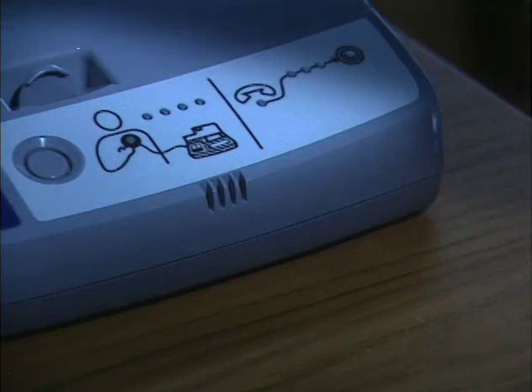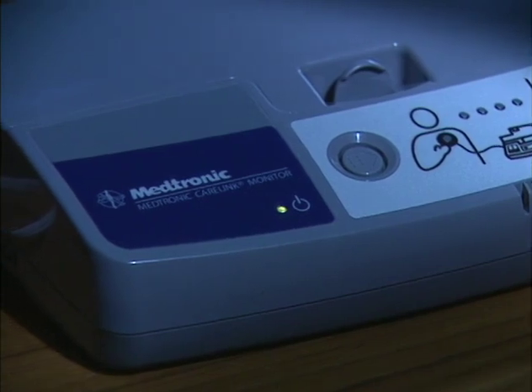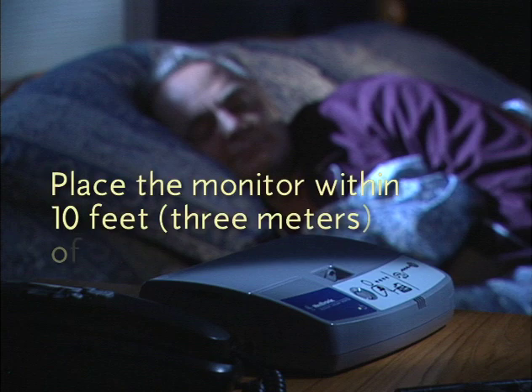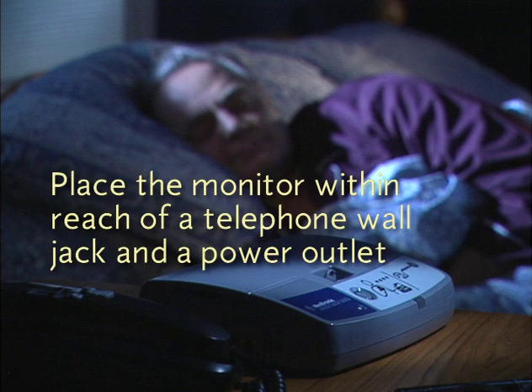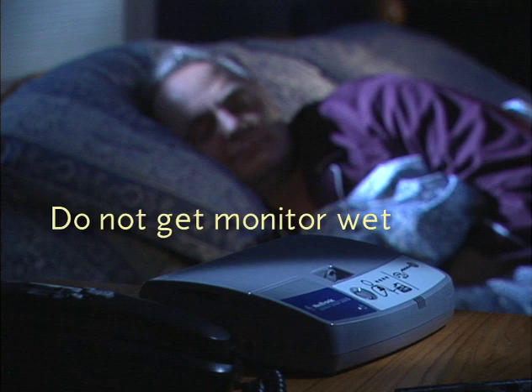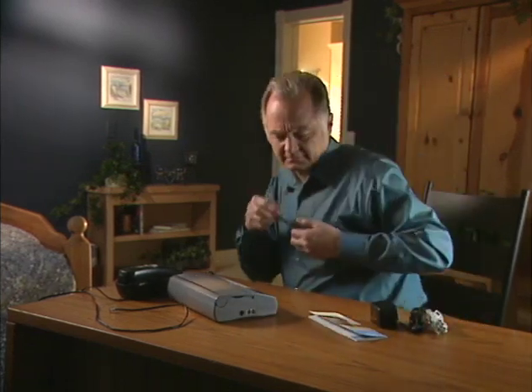Your monitor must be set up in a permanent location so that it can communicate automatically with your implanted heart device. There are a few things you should consider when selecting a location. The monitor should be placed within 10 feet or 3 meters of where you sleep, preferably on a nightstand or a table. Make sure the monitor is in reach of both a telephone wall jack and a power outlet. You will need access to both types of outlets for your monitor to operate properly. Finally, do not place the monitor anywhere it can get wet.